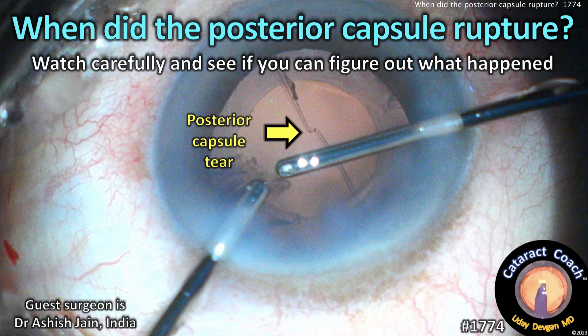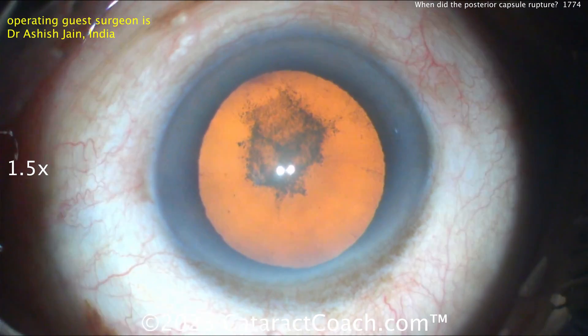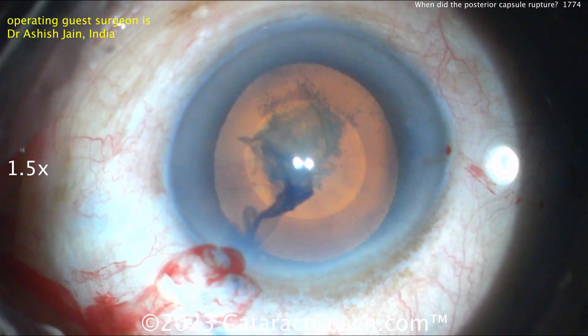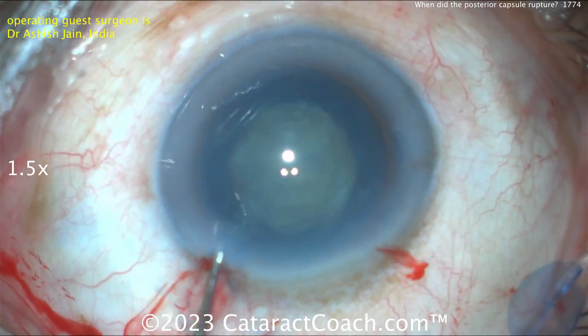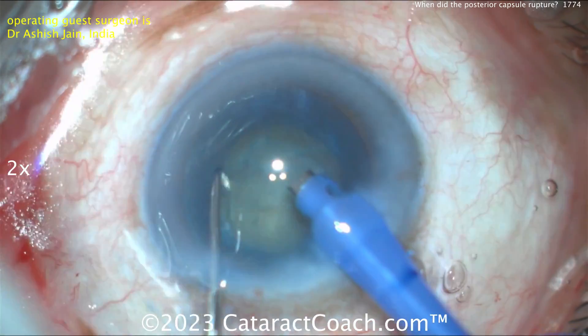cataractcoach.com — when did the posterior capsule rupture? Let's watch carefully and see if we can figure out what happened. We have a very experienced surgeon operating. There's the cataract — posterior subcapsular. Everything looks clean and normal. The rhexis is good, that went fine. Let's speed through the hydrodissection — nucleus rotates beautifully, no issue at all. Now let's get the phaco probe in.